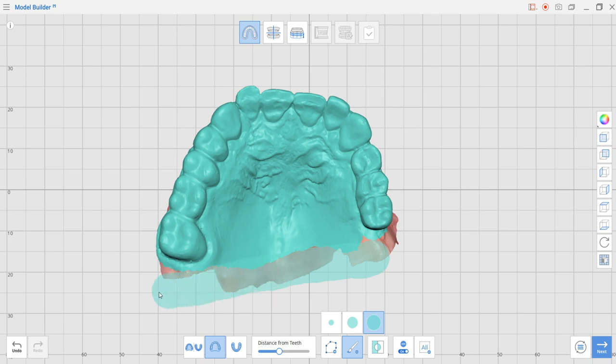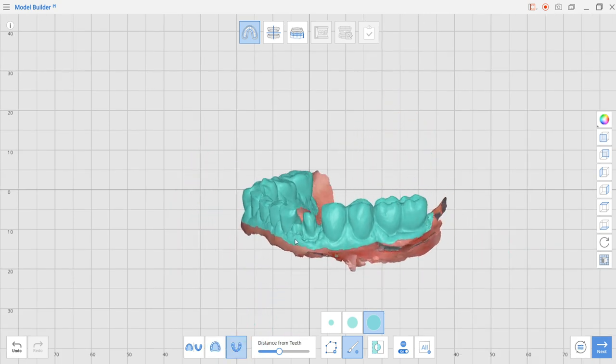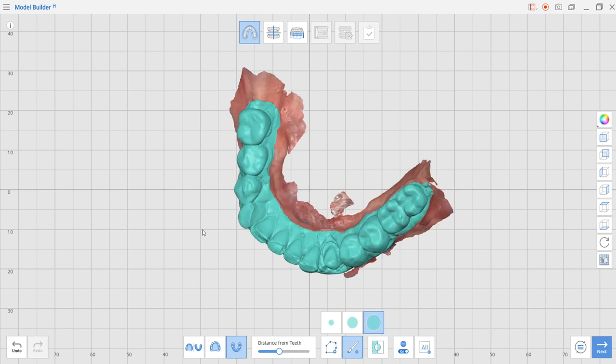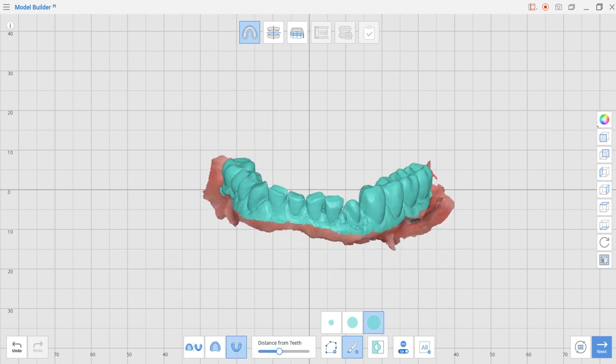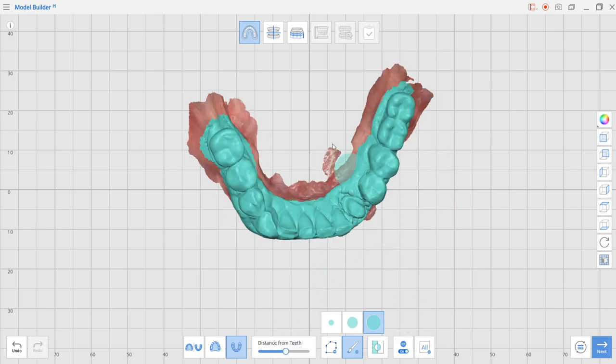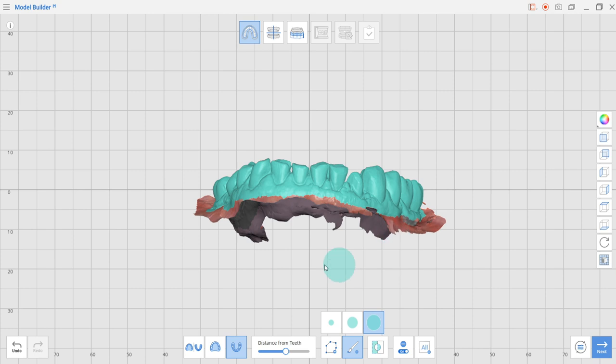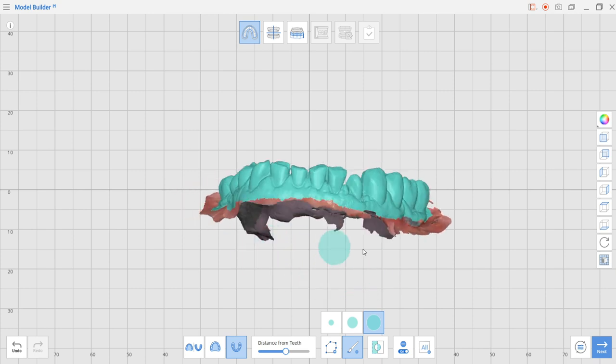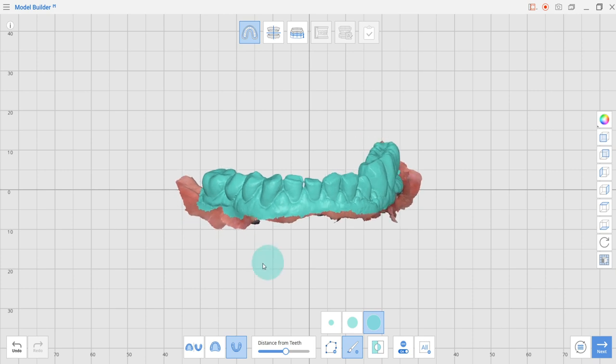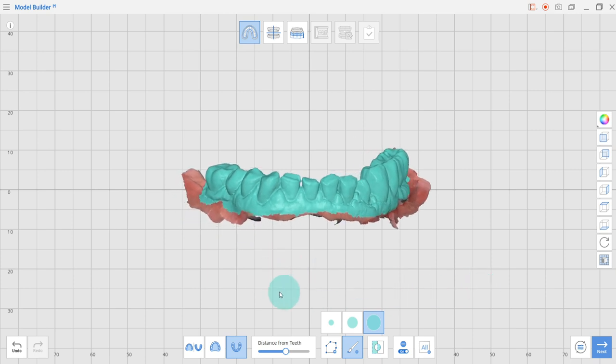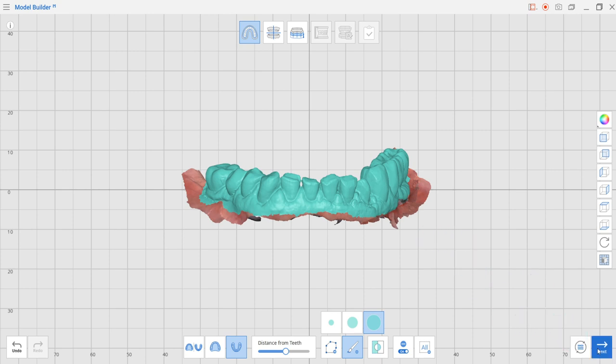Let's check the mandible as well. Here I would like to add a little bit more of the model. You just have to remember that for the mandibular, the lowest point selected is going to be the point where the base of the model starts to be generated. So if you have a big area selected somewhere that is going much lower or much higher in case of the maxilla, the base will not be able to go near the teeth but just start from that first area. Let's click next and go to the next step.